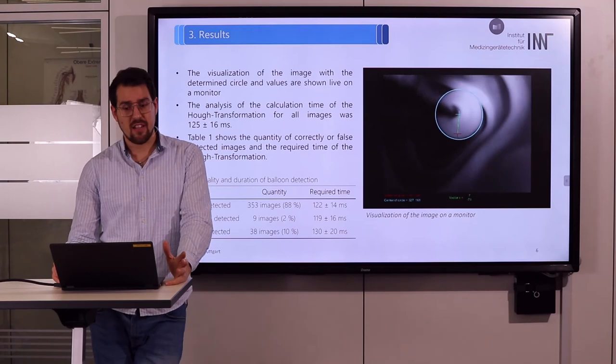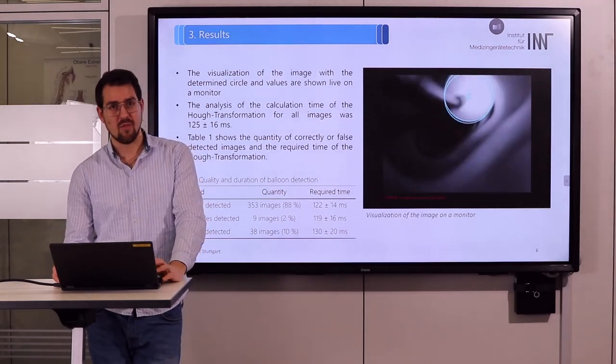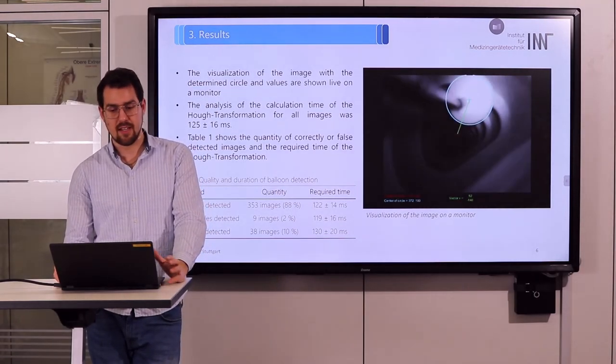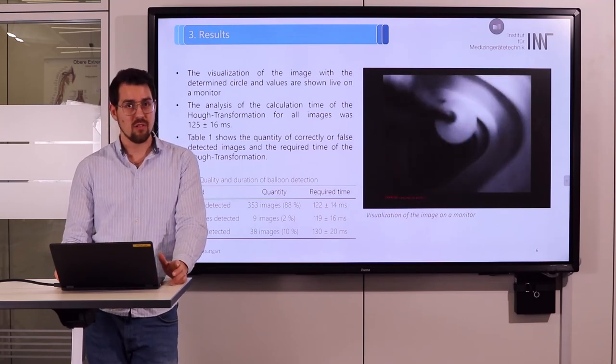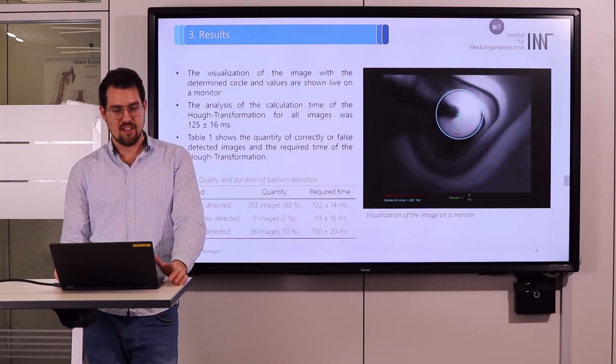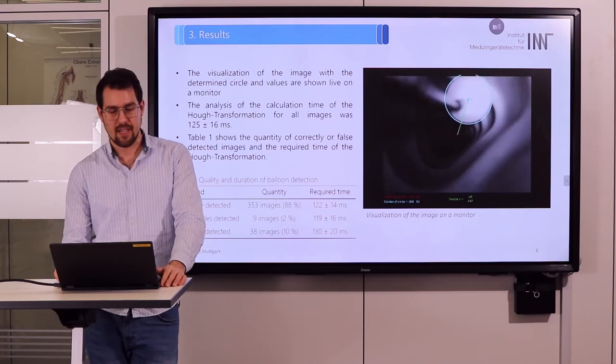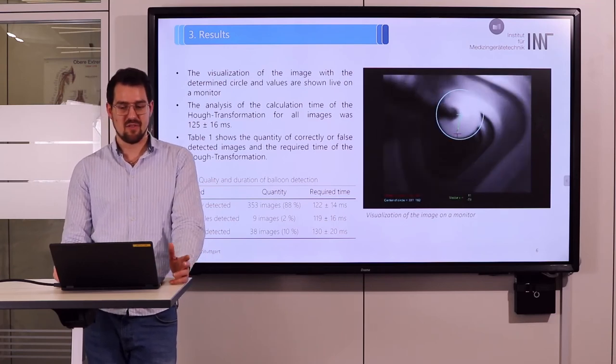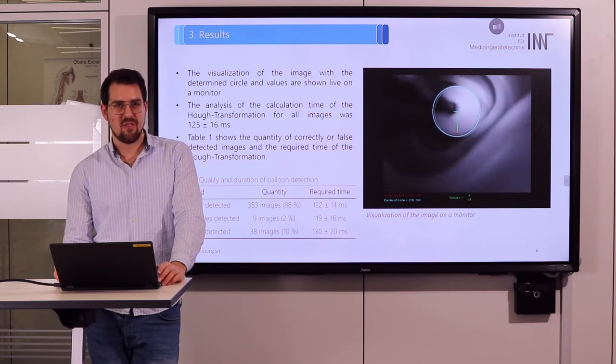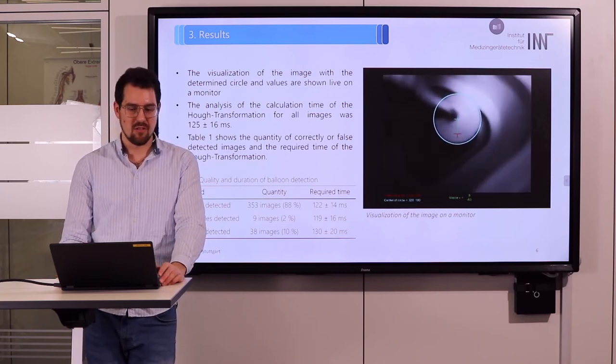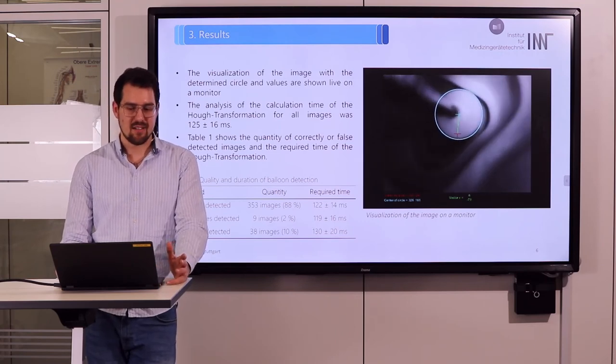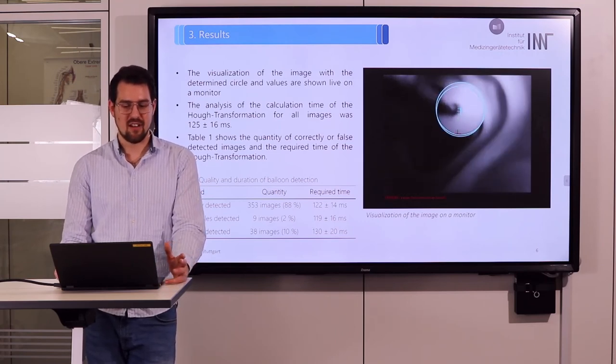On average, the Hough transformation took about 125 milliseconds, and in 88 percent of all images the balloon was identified as a circle. In 2 percent of images several circles were found, making it impossible to distinguish which belonged to the balloon. In 10 percent of images no circle was identified at all.